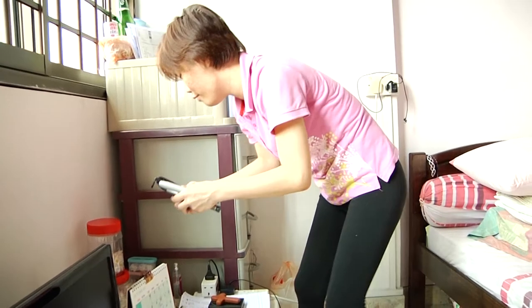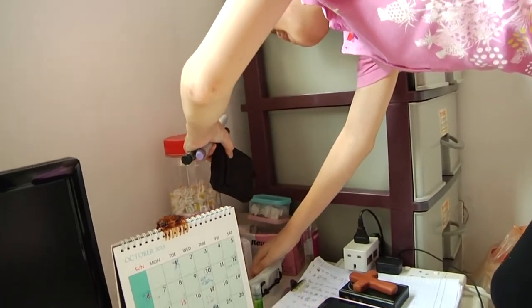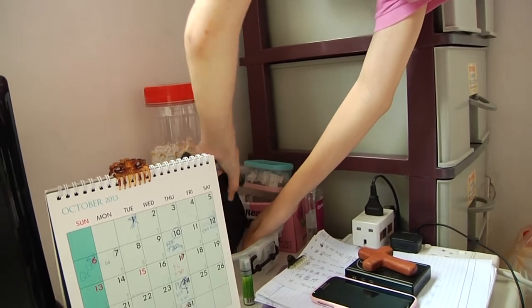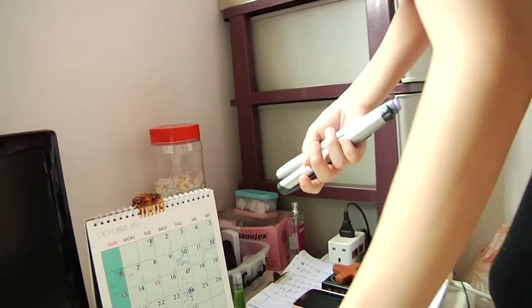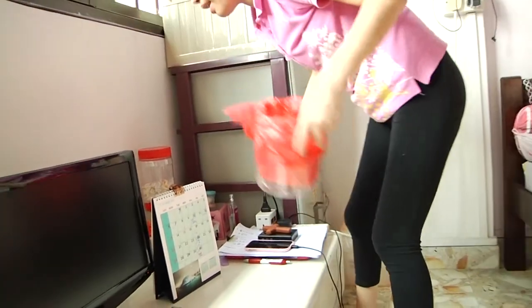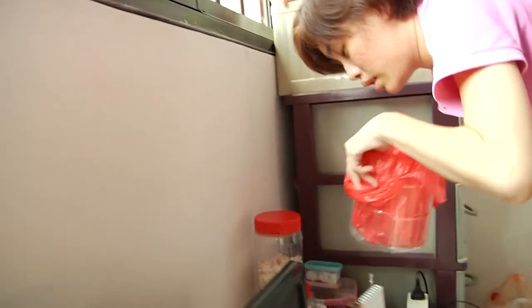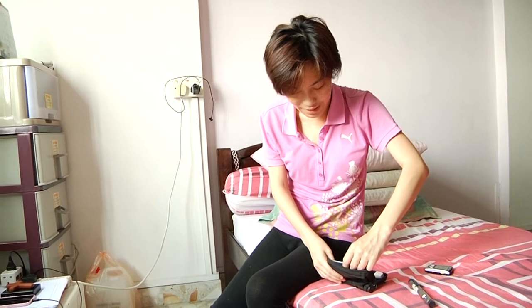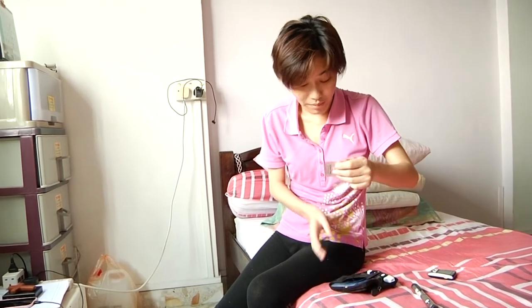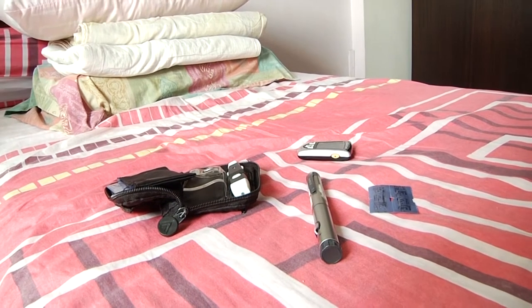This is where I leave my things: my glucometer, my swab, my needle, my hypocount tester, everything I'll put here. Then this is the bin that collects my used needle. Yeah, I am actually doing my blood testing now. Yeah, I'm preparing my equipment.